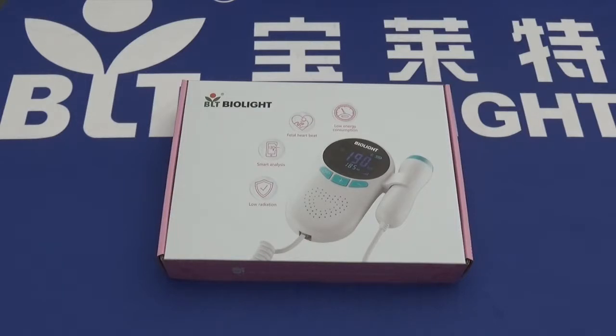It also displays the average fetal heart rate and real-time fetal heart rate at the same time. It's compatible with Bluetooth 4.0 and a smart device app.